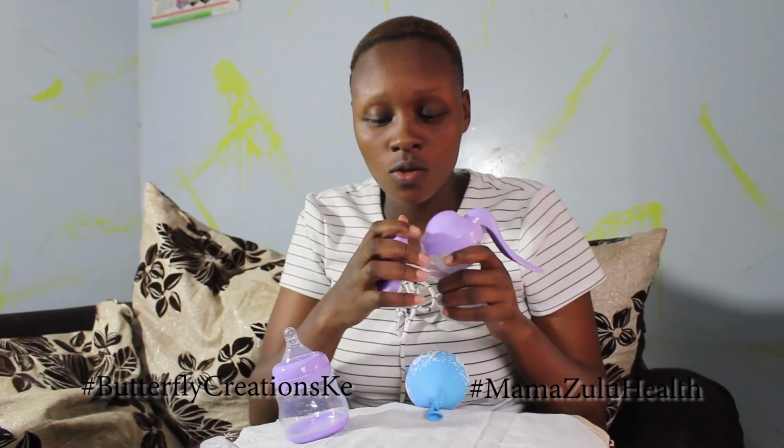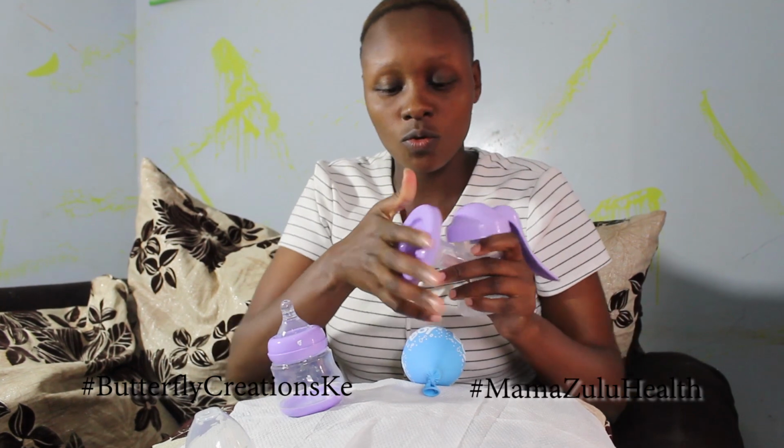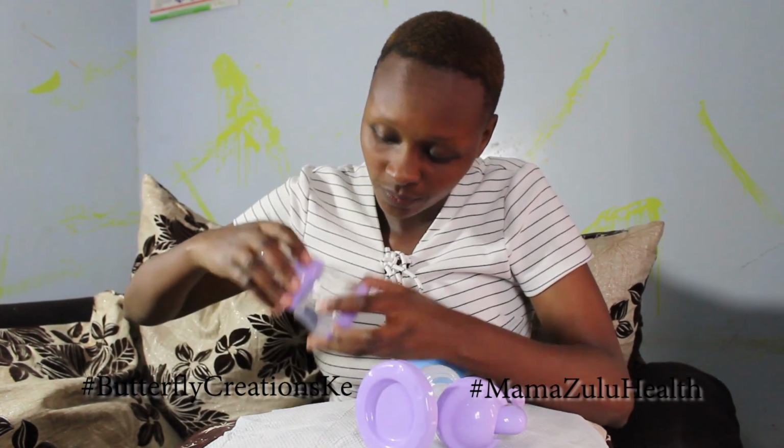You first leave them to air dry, or you can wipe them if you are very sure that hygiene is key. Then you can do wiping, but I like leaving them to air dry on their own before I assemble this. So you put this back, and then you use the cup to do this, so that you're sure nothing will go in, and you're sure that the next time you use this it will be completely clean. And then this one is to close this. That will make sure everything is clean throughout.